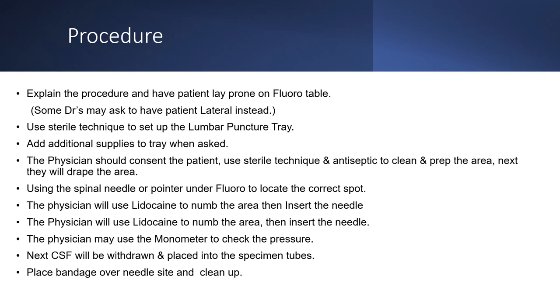The physician should consent the patient and use sterile technique and antiseptic to clean and prep the area. Next, they will drape the area. Using a spinal needle or a pointer, the physician may, under fluoro, locate the correct spot. The physician will use lidocaine to numb the area, then insert the needle.